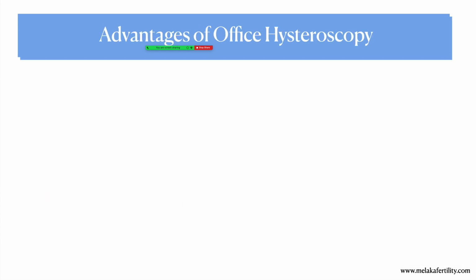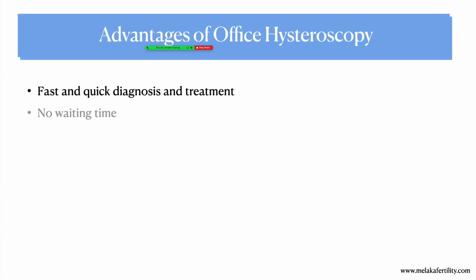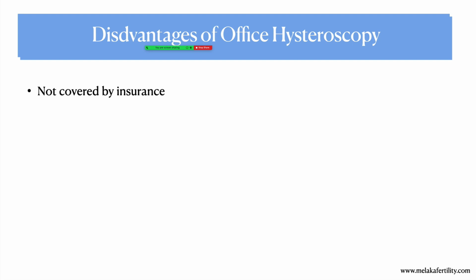So advantages of office hysteroscopy, you all know, is fast, quick diagnosis, no waiting time, no anesthesia, low cost to patient. As you can see, I've done most of my office hysteroscopy, almost 95% of the time it can be done in the office setup. And the disadvantage is, of course, in my country, it's not covered by insurance.